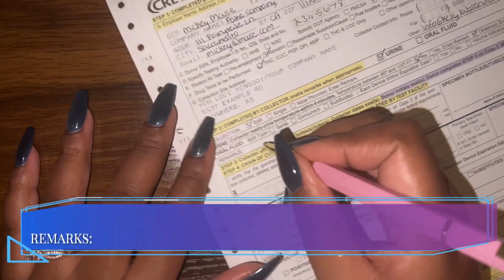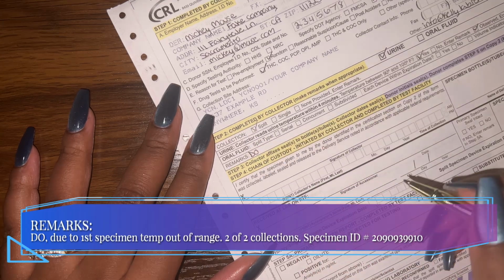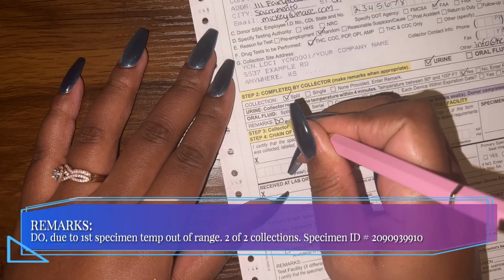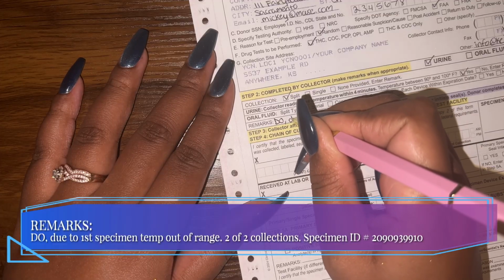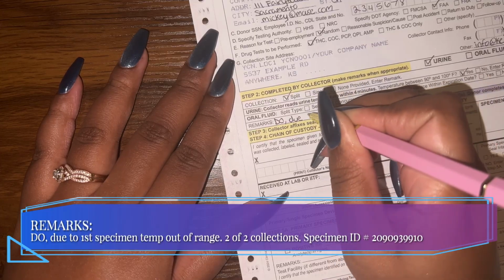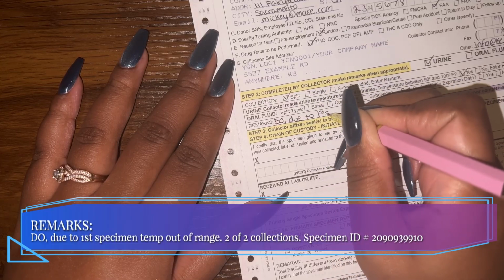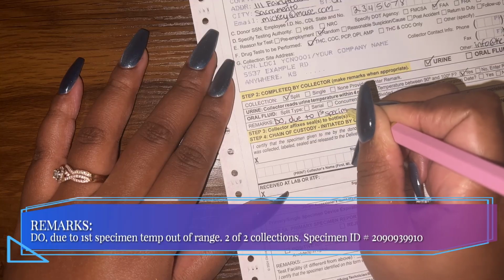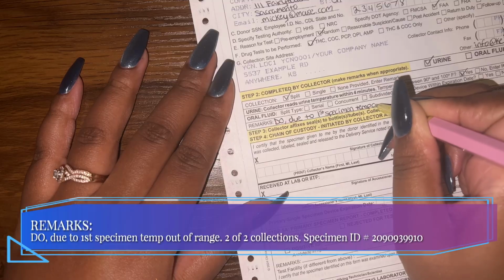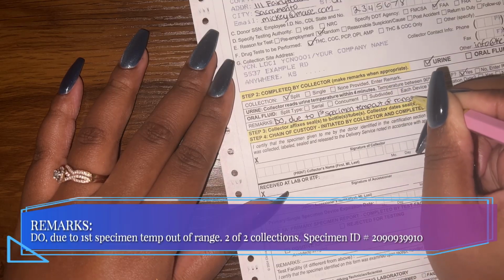So what is our remark going to be for direct observation? We are going to put DO, which stands for direct observation, comma, due to first specimen temp out of range.